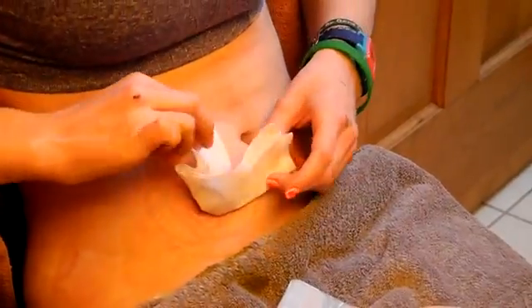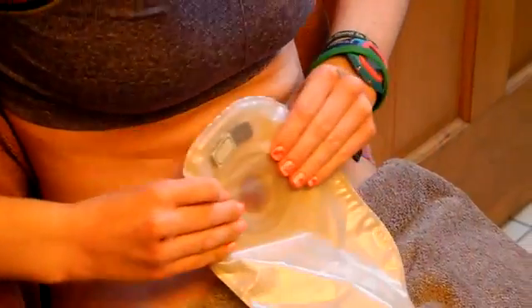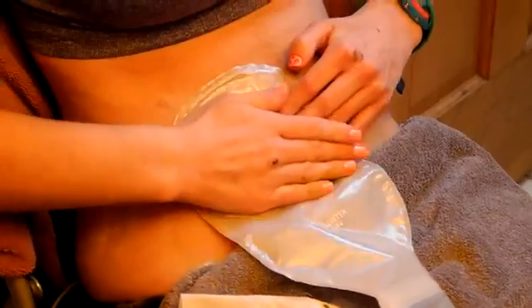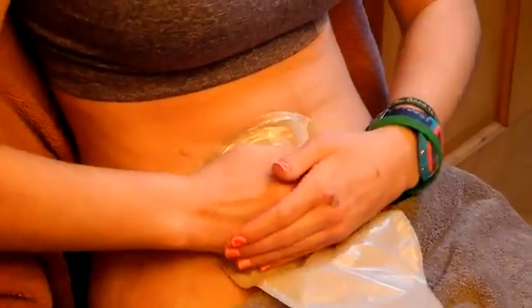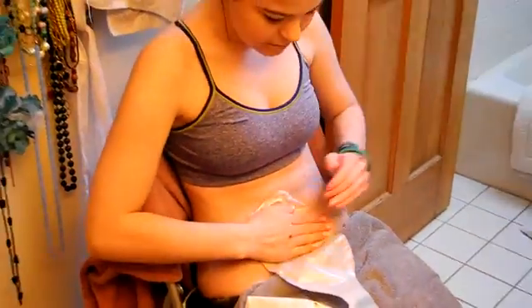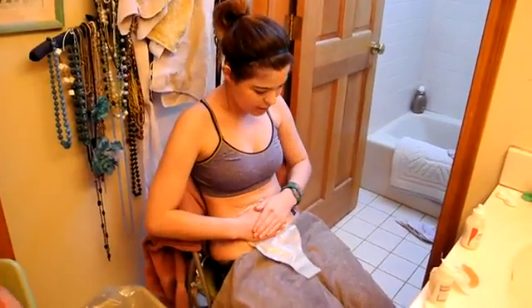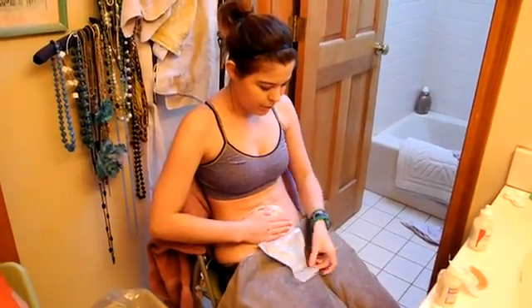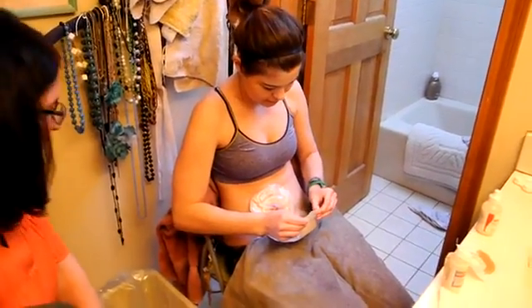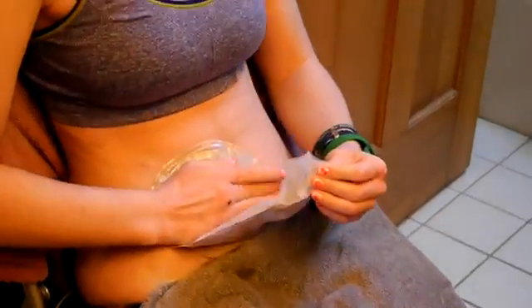So now you take your volcano off, hope that it doesn't leak, and stick this on. Alright, so there we go. Now you want to warm up the wafer barrier kind of thing, so that's really important because then it kind of sticks to your skin and it just helps create a really great seal. While you're doing that, while it's sticking on, you can open it up and crease this. It just makes it a little bit easier to empty out.